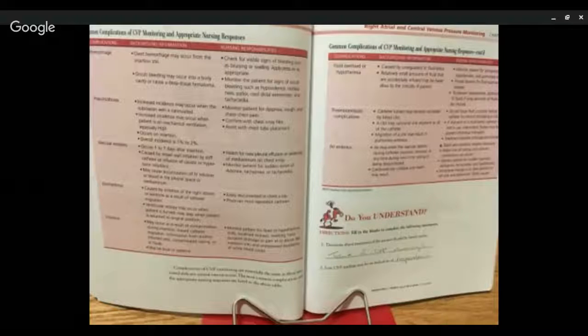You're putting a foreign object into the body. It could puncture the lungs, and that is a pneumothorax. But that rarely happens. Overall incidence of a pneumothorax is 1 to 2%.